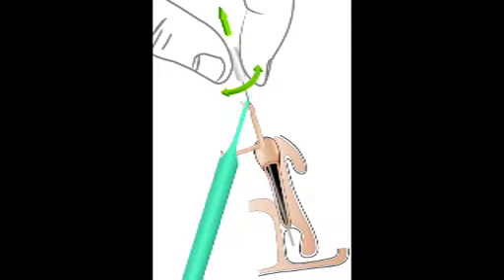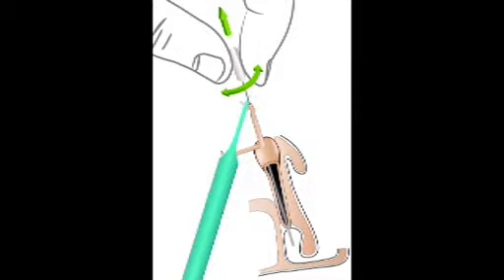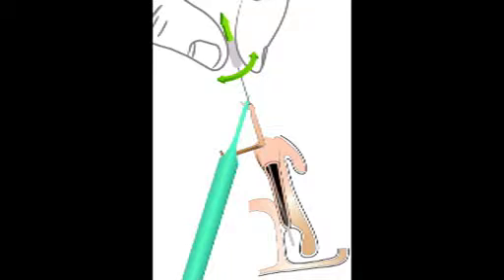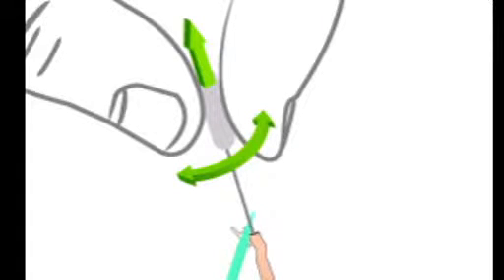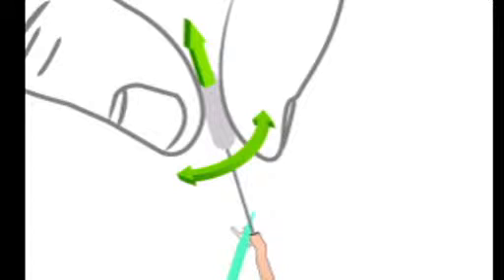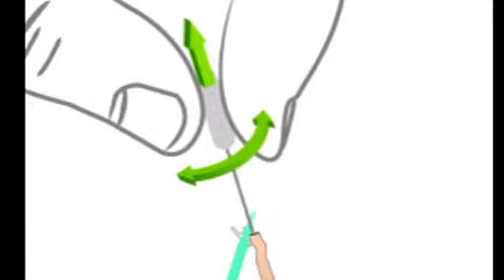Removal of the metallic guide: the fixation plug must be held firmly in contact with the punctum throughout the entire process of withdrawing the metallic guide. Removal of the guide is done slowly and carefully with multiple back-and-forth rotations while remaining in the vertical axis of the lacrimal duct, much like winding a watch.